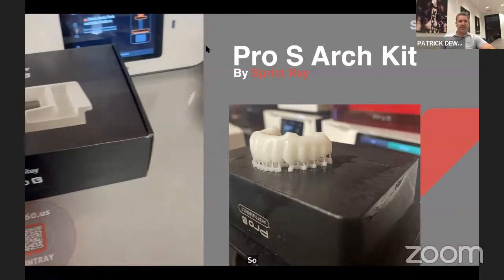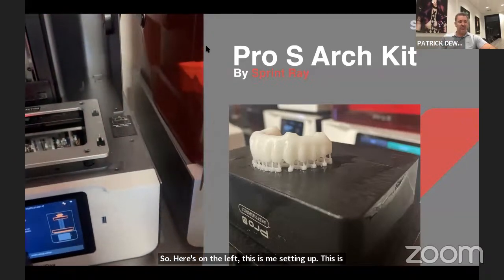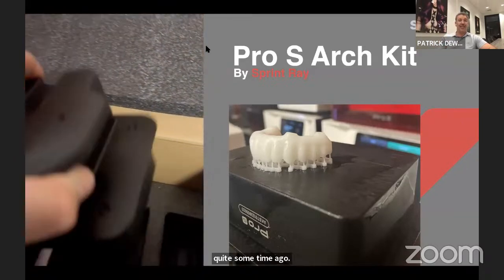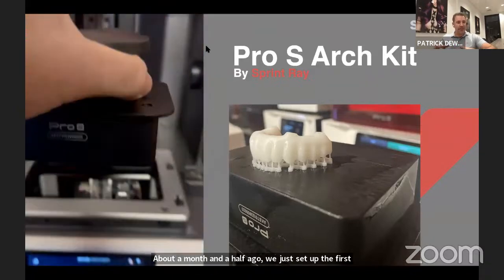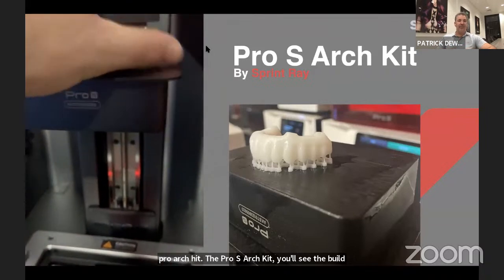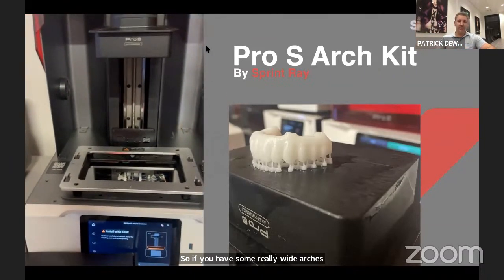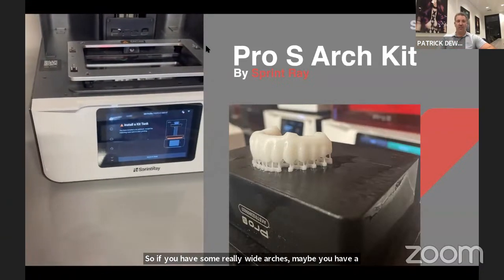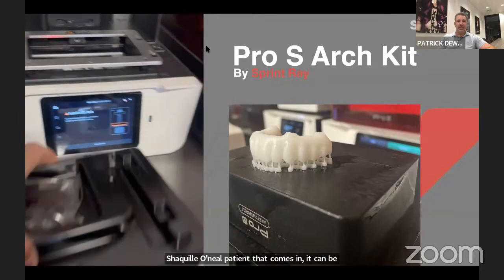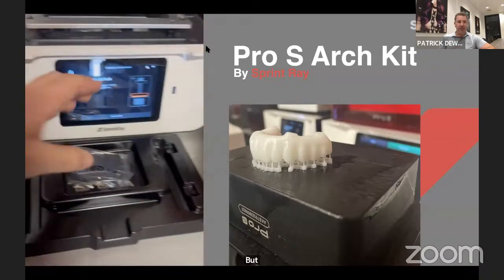So here on the left, this is me setting up. This is quite some time ago, about a month and a half ago. We just set up the first Pro Arch kit, the Pro S Arch kit. You'll see the build plate's a little bit smaller than normal. So if you have some really wide arches, maybe you have a Shaquille O'Neal patient that comes in, it can be difficult fitting up to say 3 or 4 arches on there. But if you're repeatedly able to get at least 2 arches, no problem.